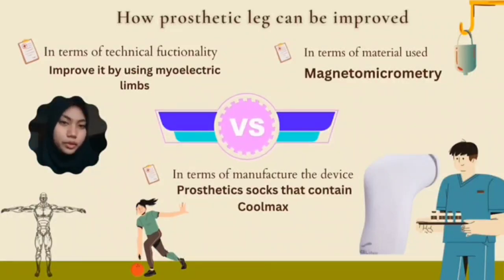So in terms of the materials, they also add magnetomicrometry in the leg prosthetic. A research team at MIT is developing a minimally invasive technology using magnetic beads to track tissue strain in real time, which is called magnetomicrometry. Actually, it can provide natural, reliable control of the prosthesis, exoskeletons, and stimulated muscle. This new technology can track a pair of magnetic beads embedded within the muscle using a mobile sensing array, which allows the nuanced movements of each muscle to be tracked individually with remarkable speed and accuracy.